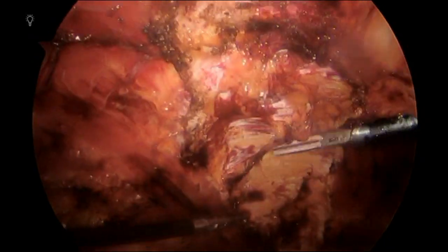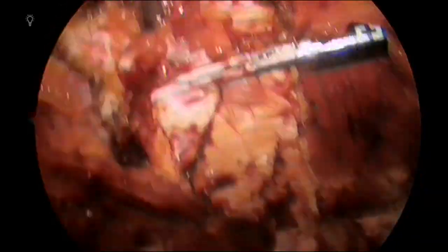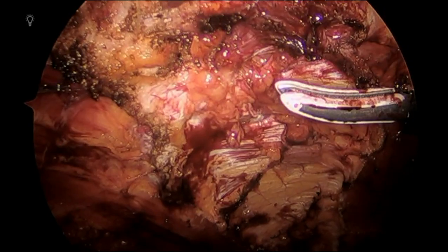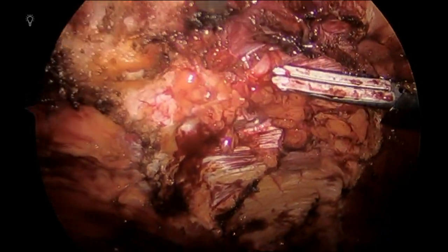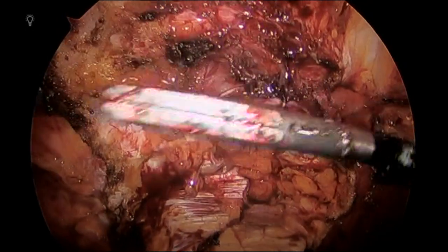Here we can see the rectus diastasis. There are three small defects. That's the supraumbilical defect. There is another one smaller there. And the umbilical hernia.